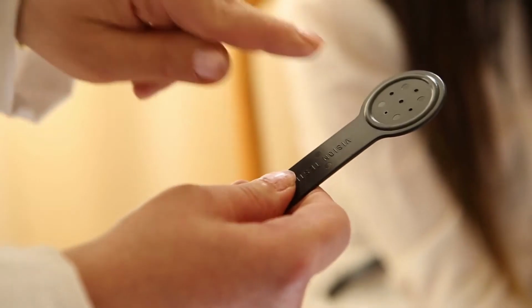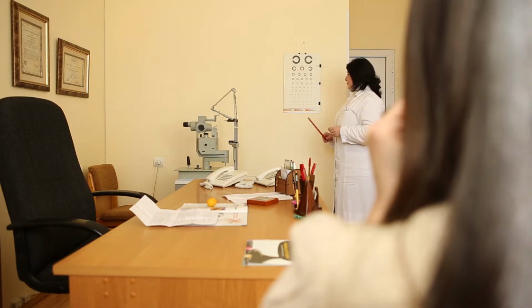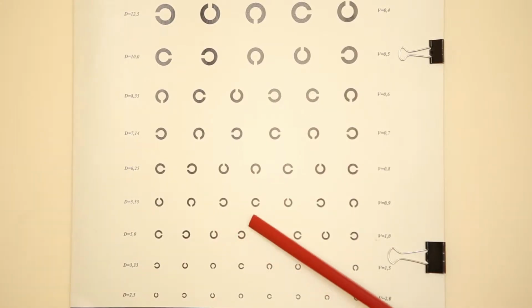Visual acuity testing is the first step of eye examination in all patients. The only exception is the patient with chemical burn, who requires urgent irrigation. Measure the visual acuity for each eye. Use a pinhole if acuity is worse than 20/30, equaling 0.7.